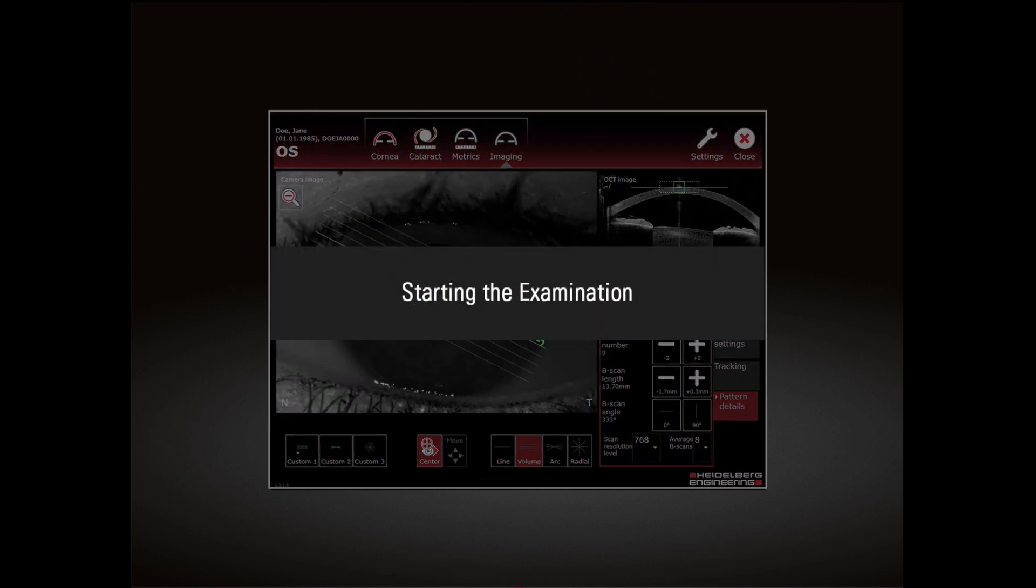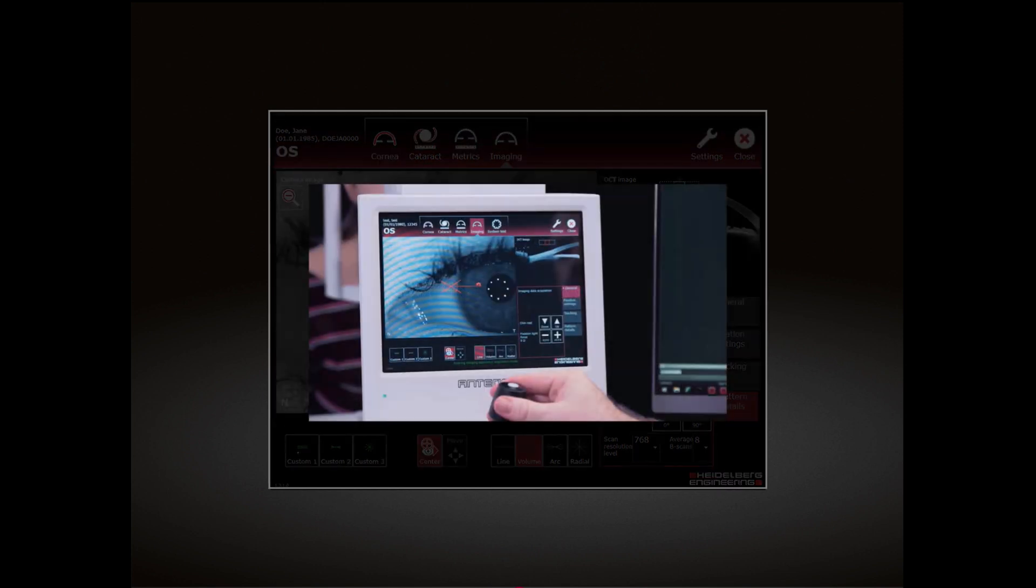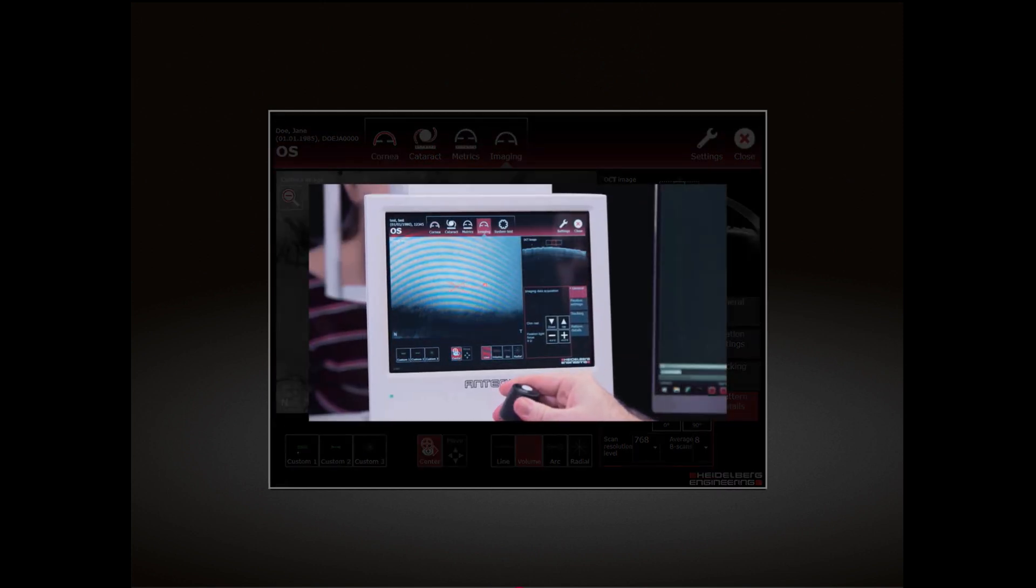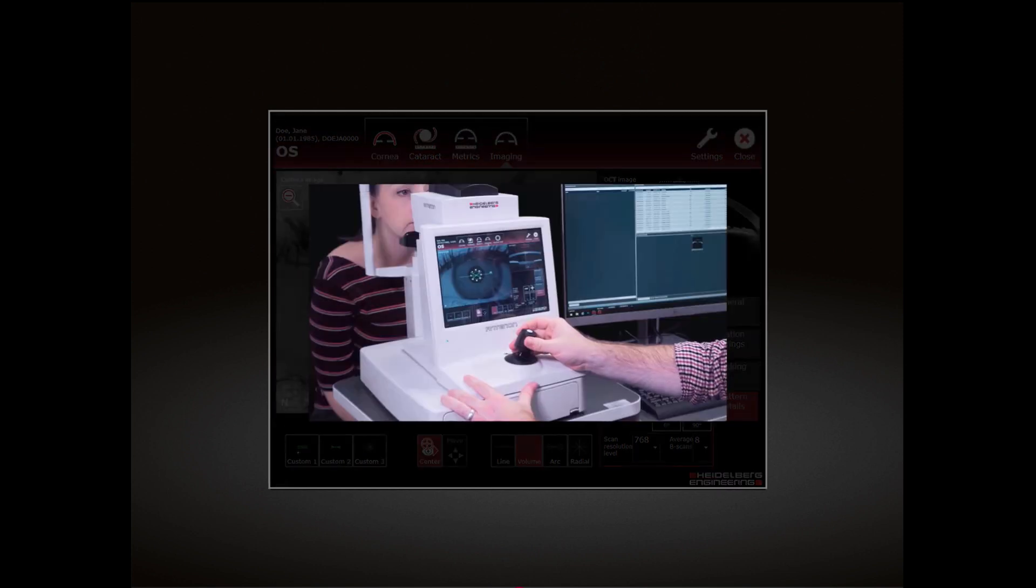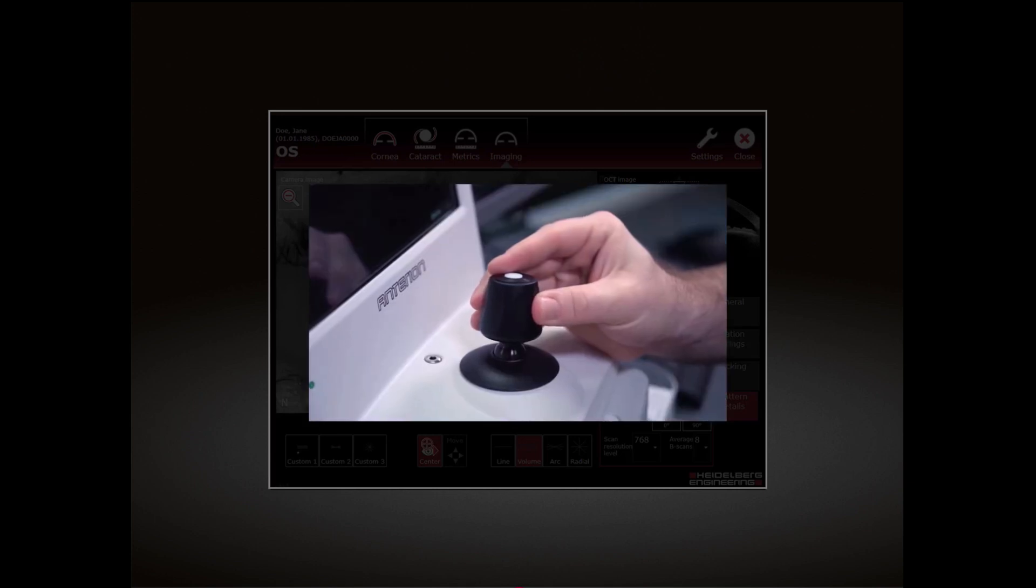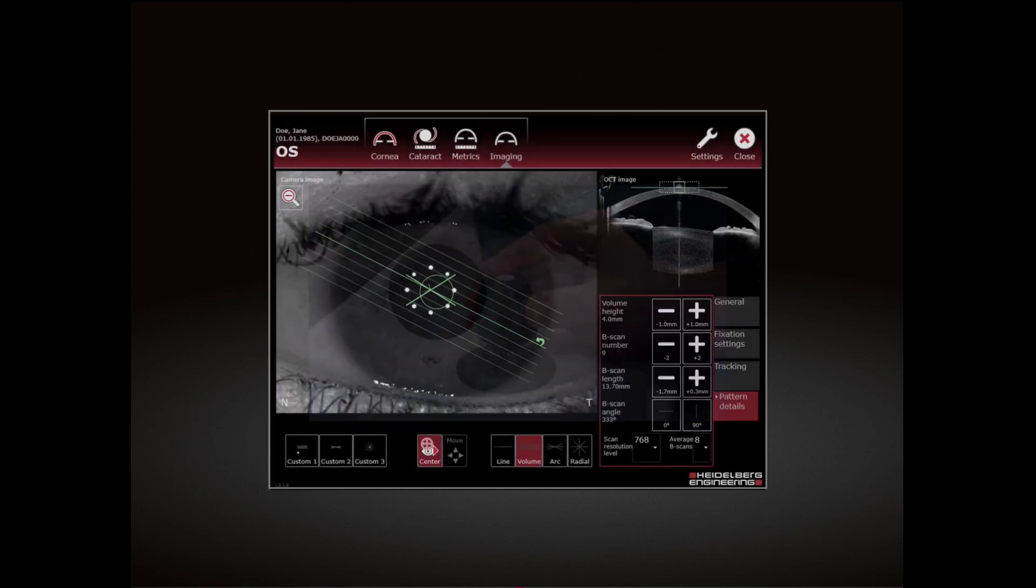Starting the examination: Use the joystick to align the camera laterally. Carefully move the camera towards the patient's eye.